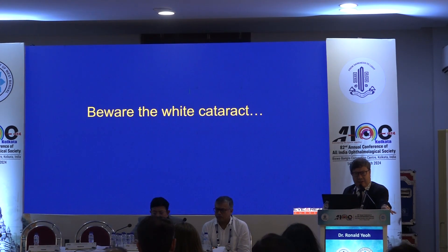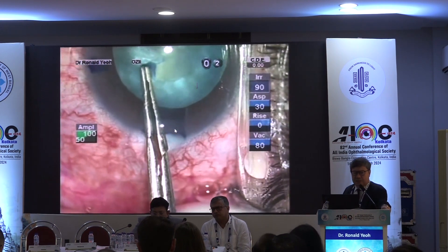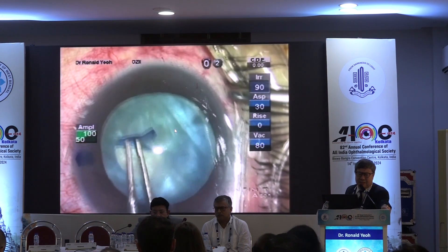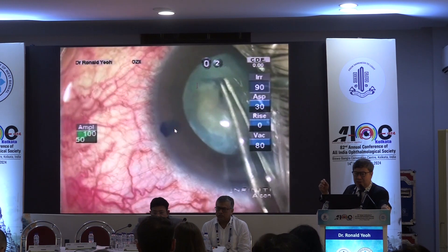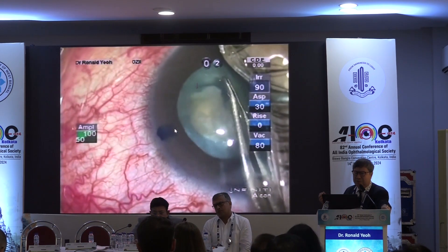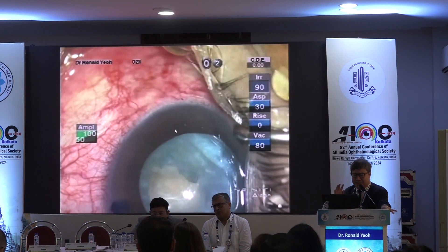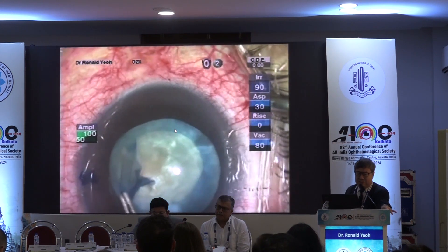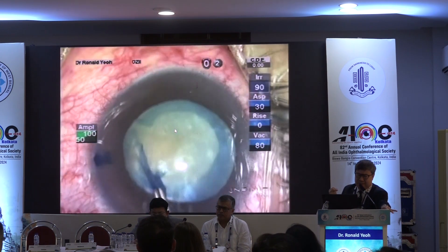But you've also got to beware the white cataract. As Forrest Gump once said, you never know what's inside a box of chocolates — you never know what's inside a white cataract. If you look at this particular white cataract, this is quite an old clip so the quality isn't fantastic. I'm tearing around and you can just about see the band that's just in front of my anterior capsular flap. And then you saw how that anterior capsule tore off because the trypan blue was making your capsule more friable. When you see that tearing happening, it means there's enough resistance to pull. So I desisted and thought I'd come around from the other direction to meet that area of resistance. I thought it's only half a millimeter — I'm just going to tear through it. Whoops.